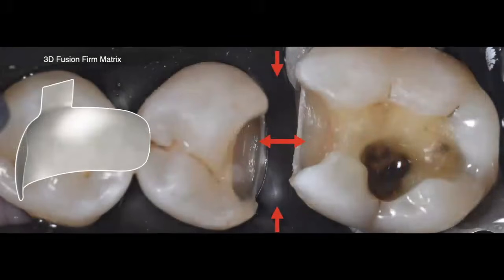Now, when I have cases like this, you can see that these two proximal boxes, this is a really complicated case. It's a difficult case to restore, not only because the boxes are deep, but also because the boxes are wide and there's one facing the other. So it's a back-to-back type of clinical scenario. And these are the more challenging clinical scenarios that we are confronted with.